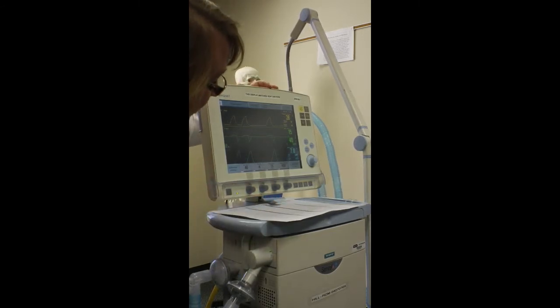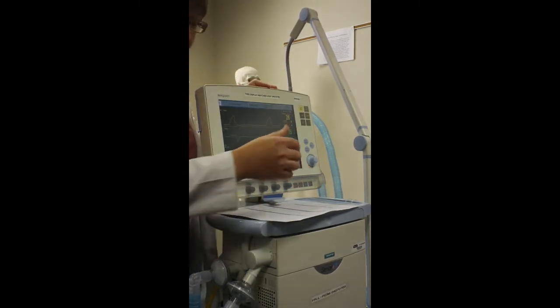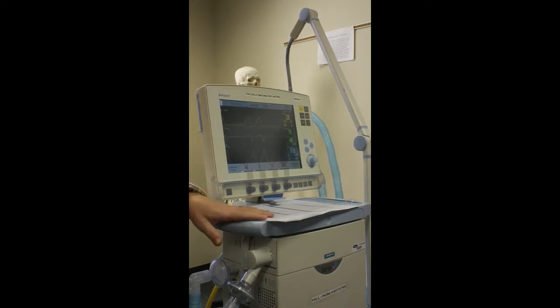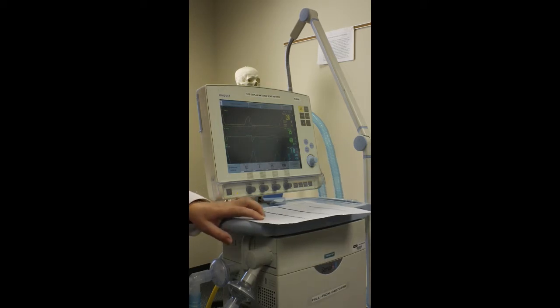So here we see our exhale tidal volume. It's red down here, and it's 472. You want it to be plus or minus 100 of what was delivered, and that's how we'll set our alarms when we get to that. So you'll put that under VT, under patient parameters. So we would put 472. It's never going to be exactly what you set. Plus or minus 100.